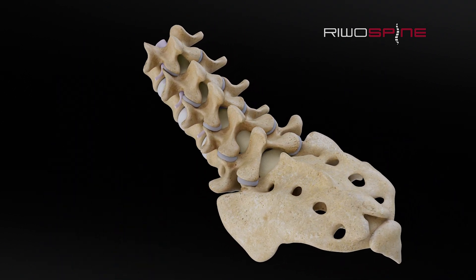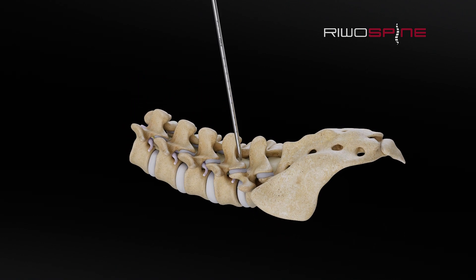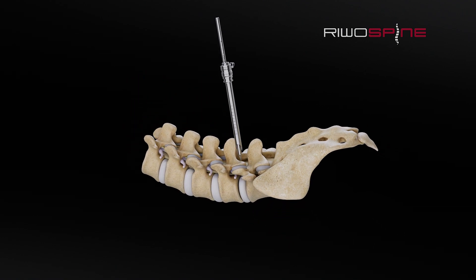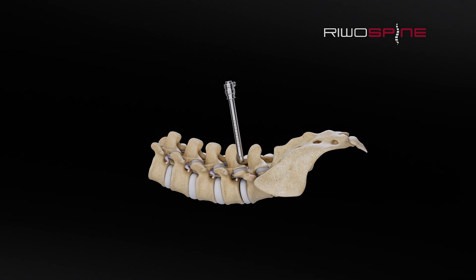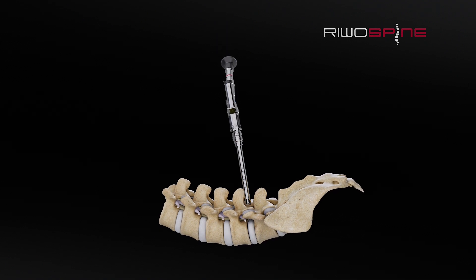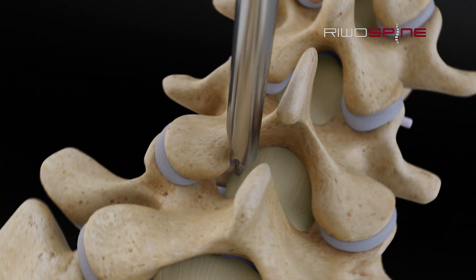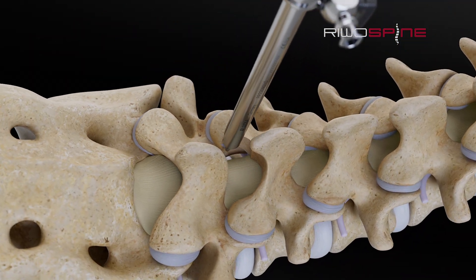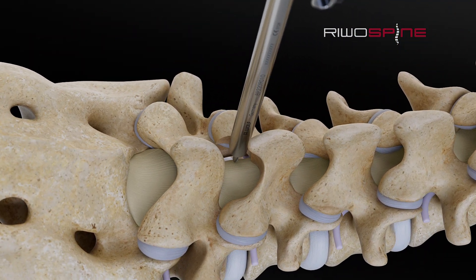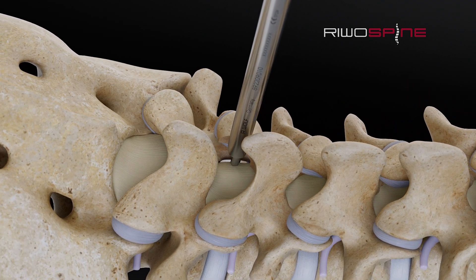First, a standardized full endoscopic interlaminar approach with the vertebrous stenosis set is performed by introducing a dilator and working sleeve. With the endoscope, the individual surgical steps can be performed very precisely and minimally invasively under vision control. After the approach, the lateral border of the lamina is resected by various drills. The ligamentum flavum must also be removed to access the spinal canal.